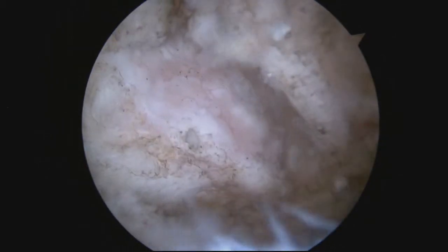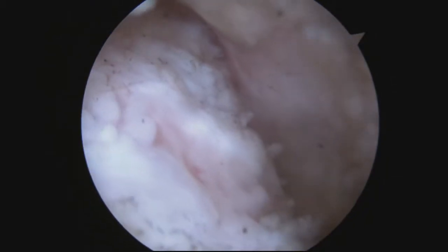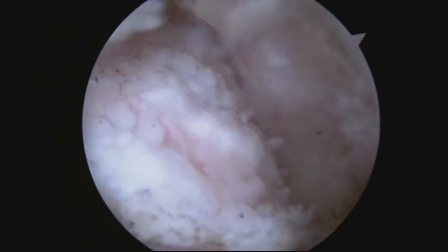You can see it moving. There's a lot of arthritis there. Instead of a nice, white, smooth cartilage surface, it's all hilly and bumpy and jagged and irregular — that causes a lot of pain.